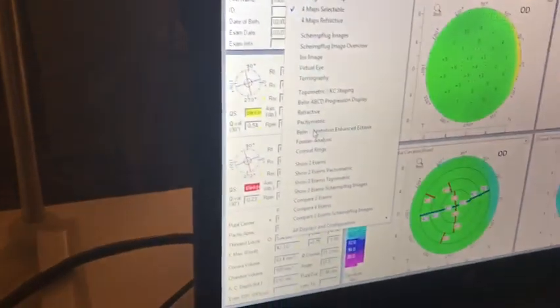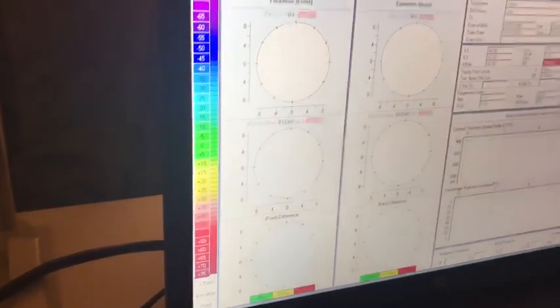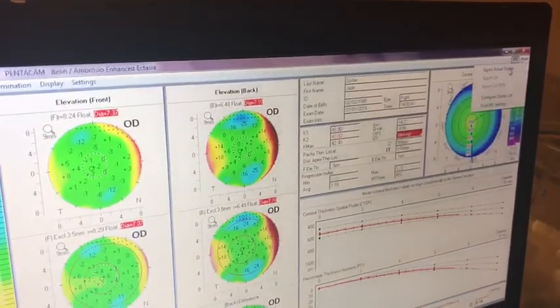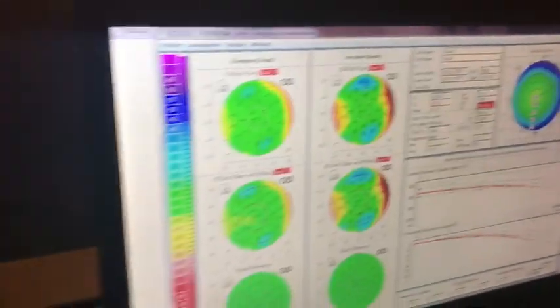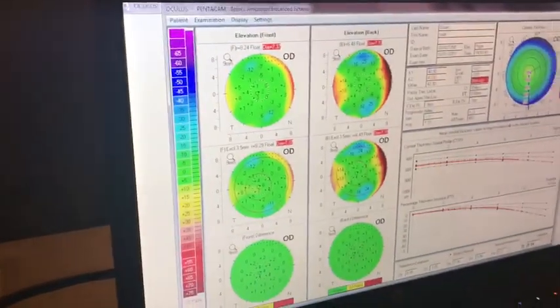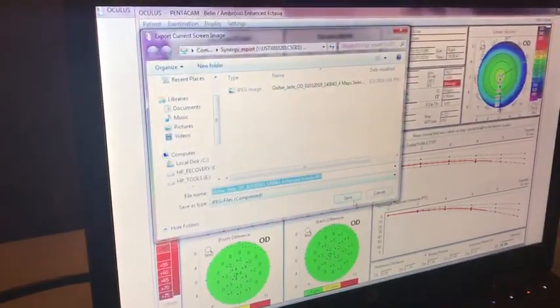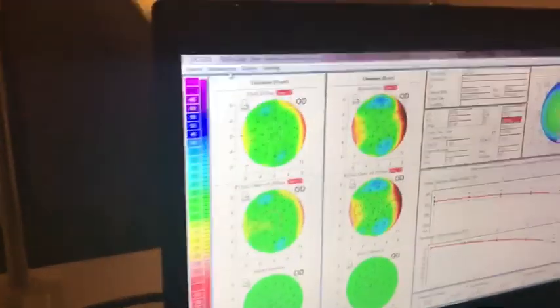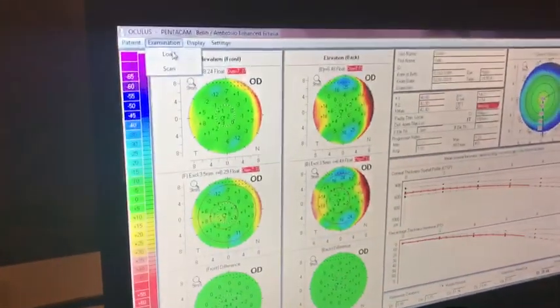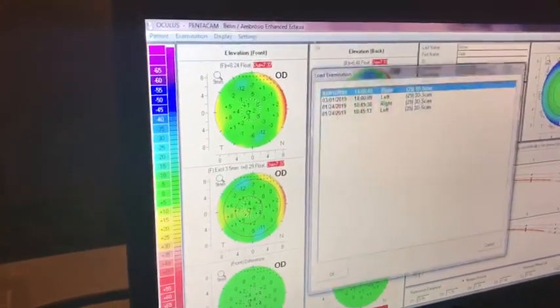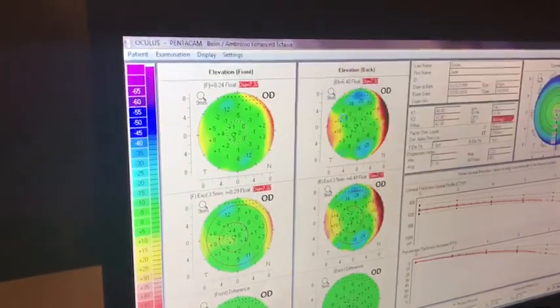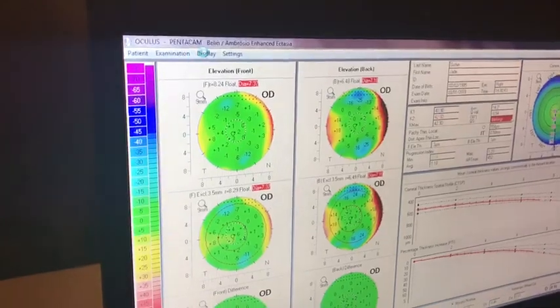And then you go to display, Balin, JPEG, export, save. And then we're going to load the other eye. So examination, load. I just sent the right eye. So now I'm sending the left eye.